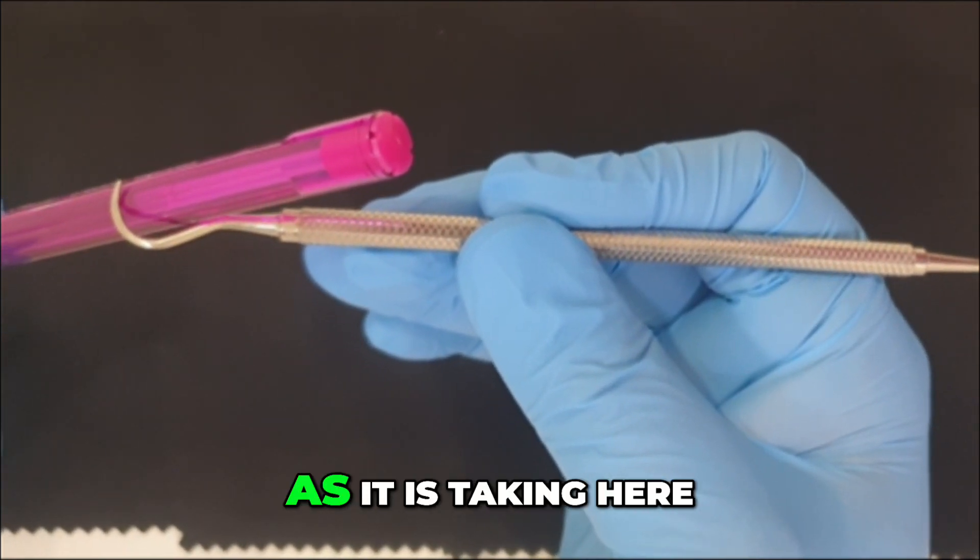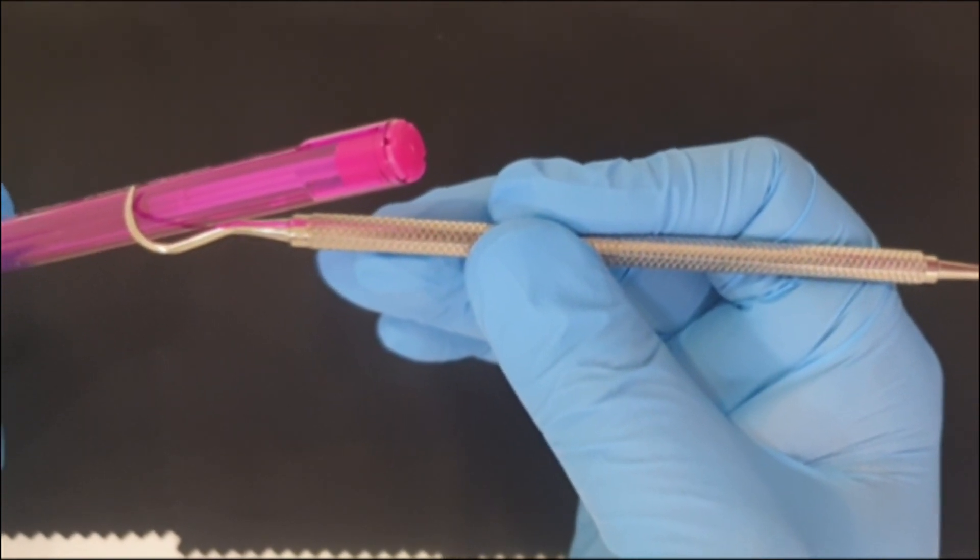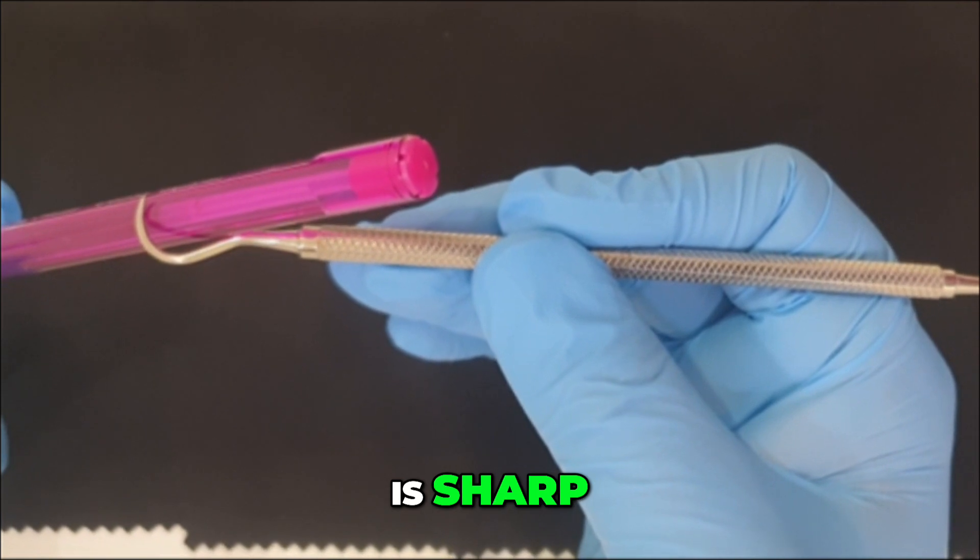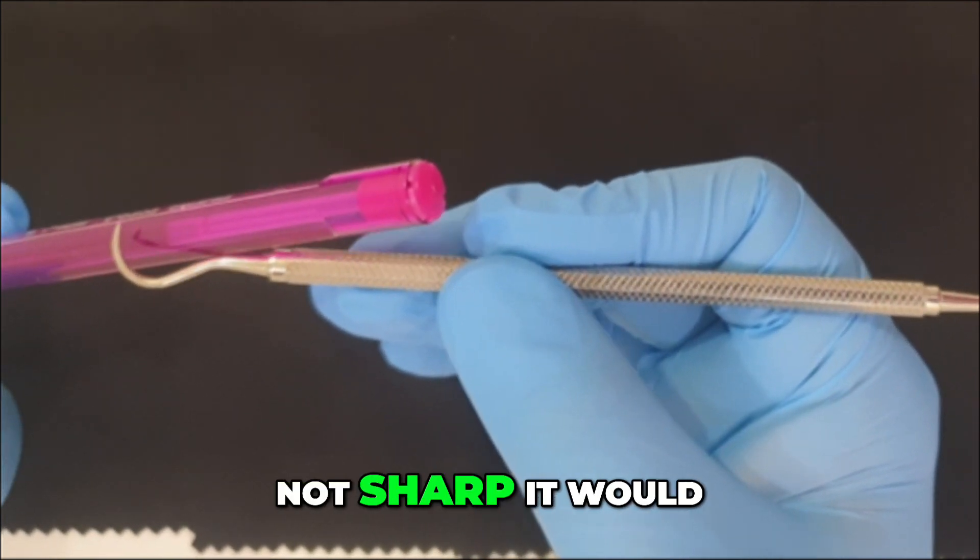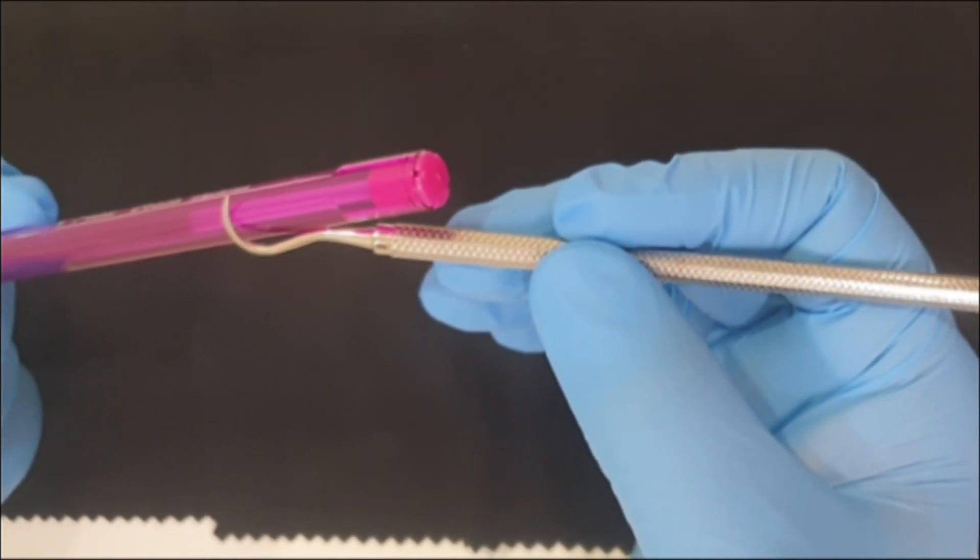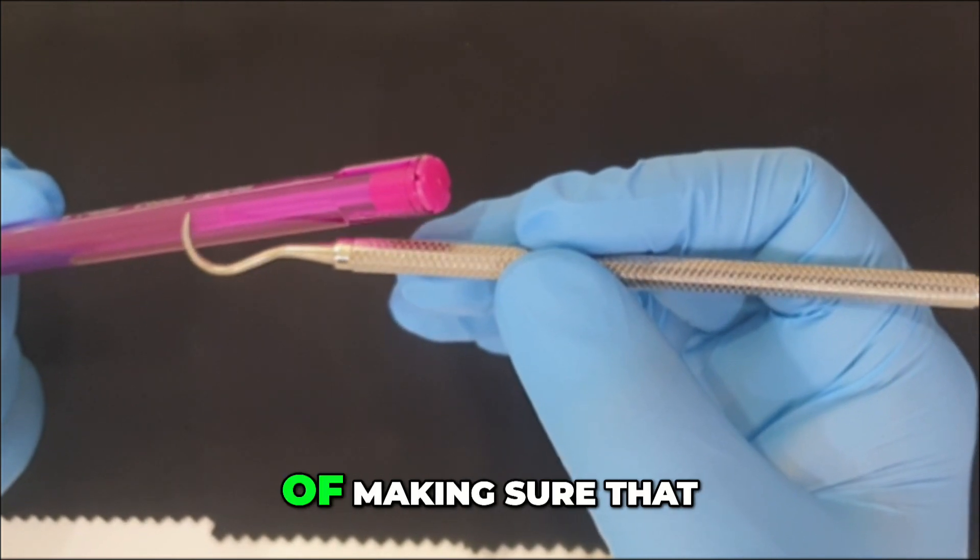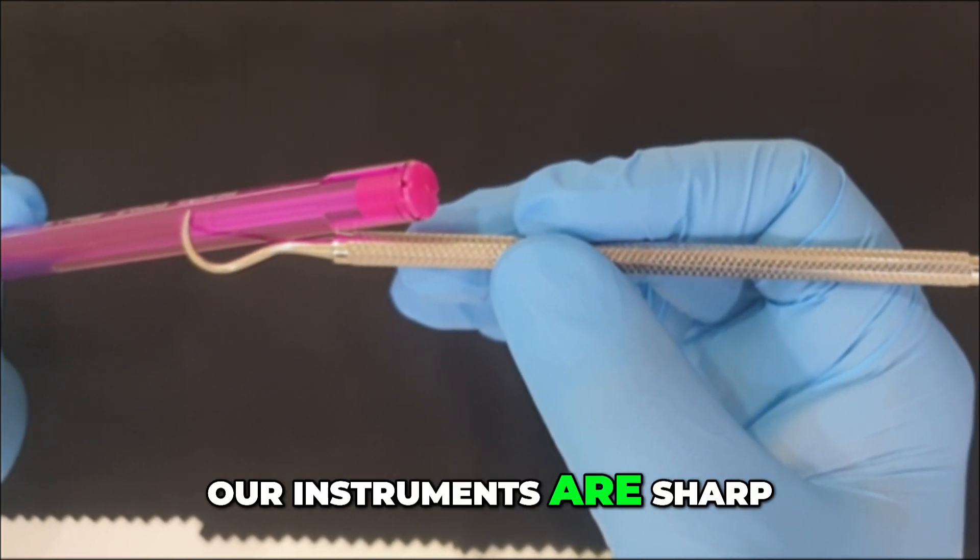If it takes bite, as it is taking here, that means my instrument is sharp. If my instrument is not sharp, it will just slide on the acrylic stick. That is one way of making sure that our instruments are sharp.